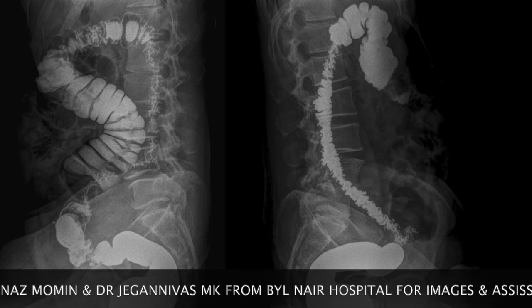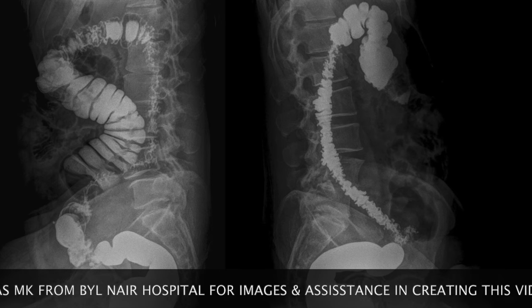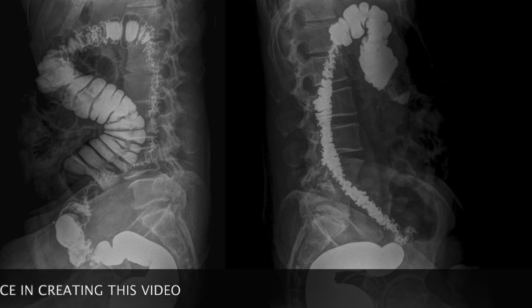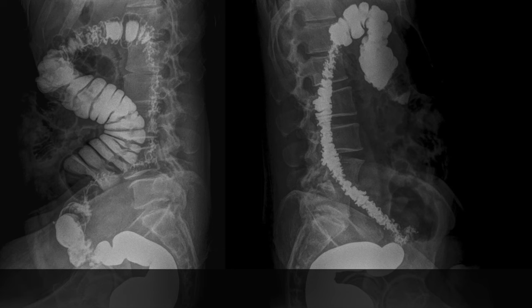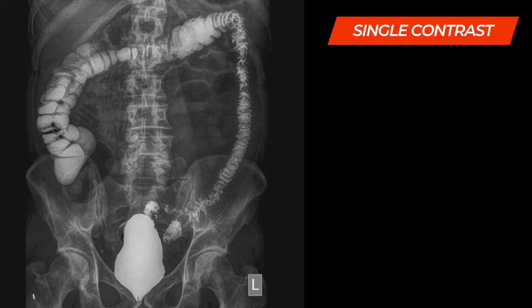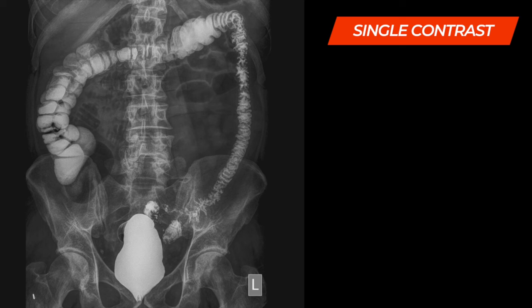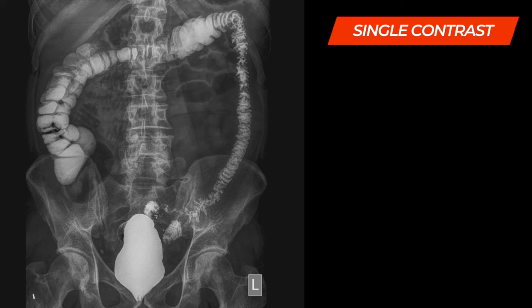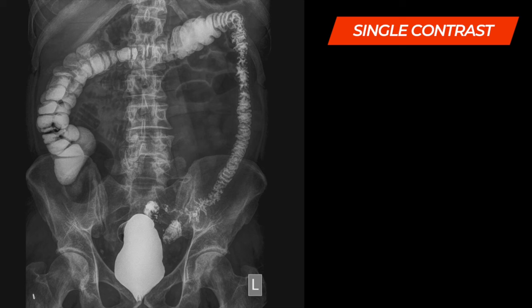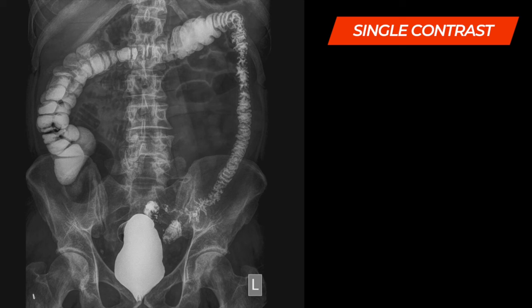On fluoroscopy via IITV, once the barium has reached the rectum and is moving towards the splenic flexure, turn the patient right side down so the barium moves from the splenic flexure down through the transverse colon to the hepatic flexure. Then make the patient supine with the head raised so barium moves towards the cecum. If the IC junction is lax, you may get barium entering the terminal ileum. Then take single contrast study pictures on 14x17: supine, prone, rectum lateral to see the presacral space, and both obliques.